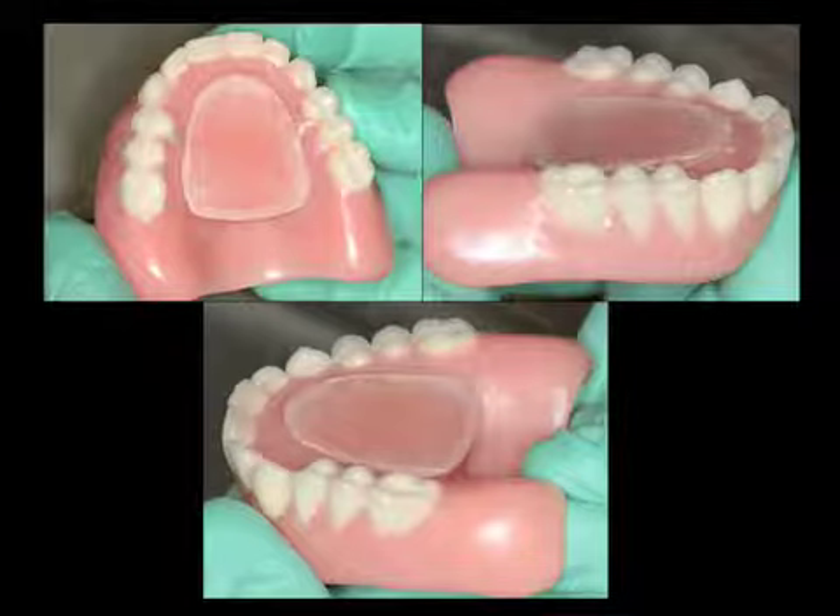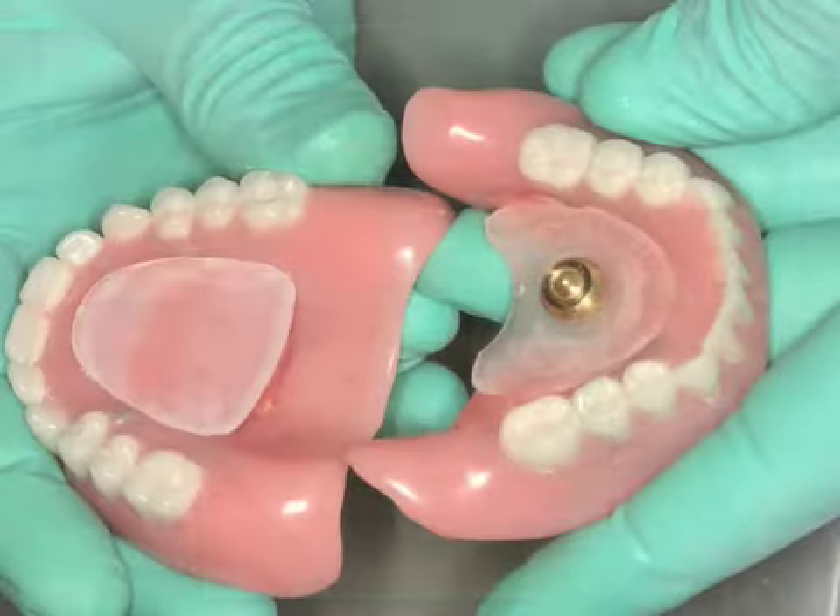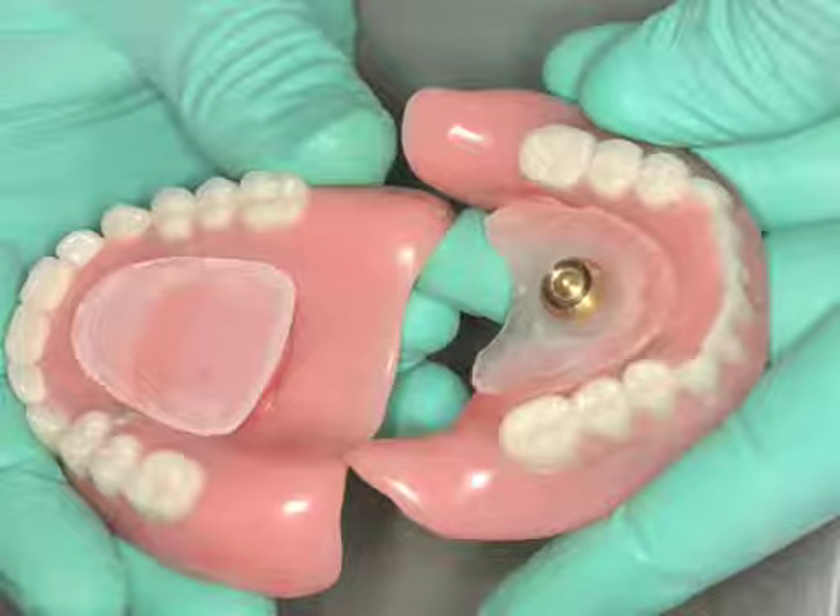The striking plate is in a slight anterior-posterior position. Now you can observe the striking plate seated and the mandibular pin and nut inserted.